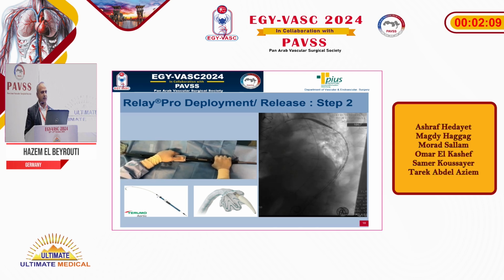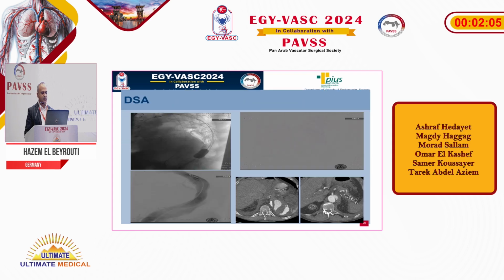As you can see here, the deployment of the stents. After ballooning of the TEVAR, the DSA showed further perfusion of the ruptured false lumen, which we call type R entry flow.